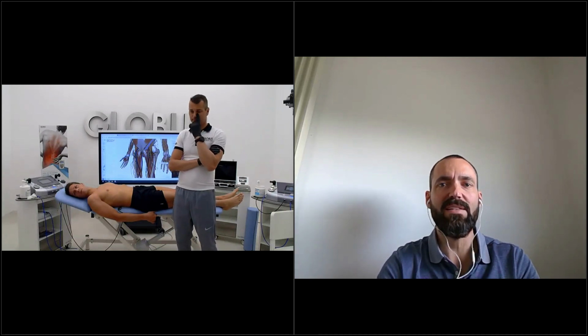Exactly. The exercises are also very important, and we can combine the hands-free during the eccentric or reconditioning exercises. Always evaluation is important: understand which phase we are in, and then decide which treatment to use in that moment.